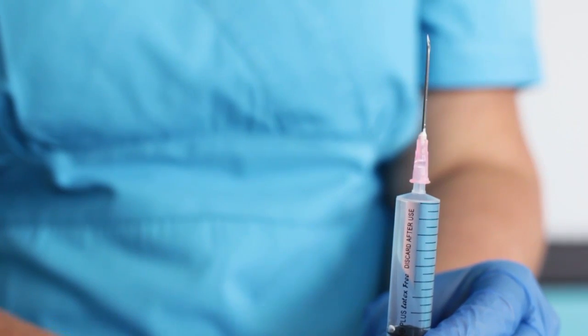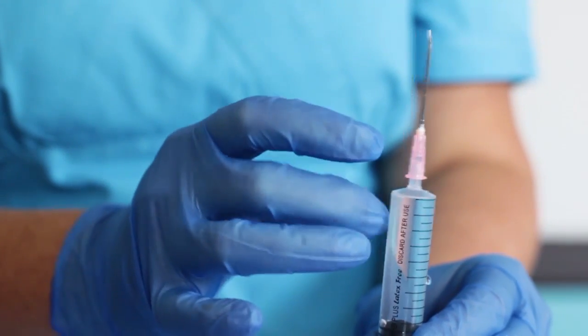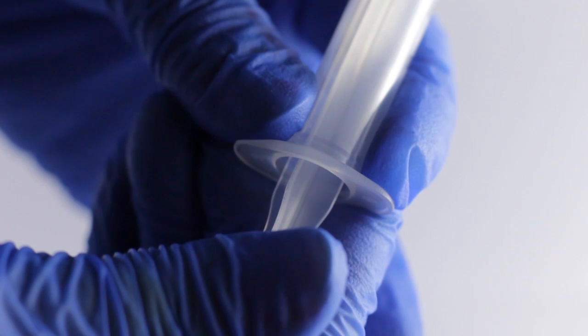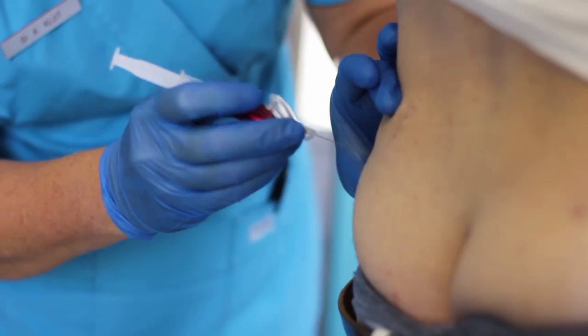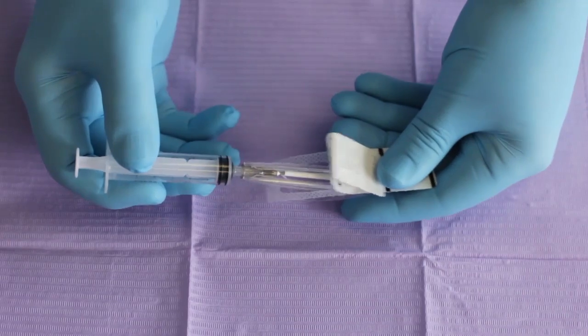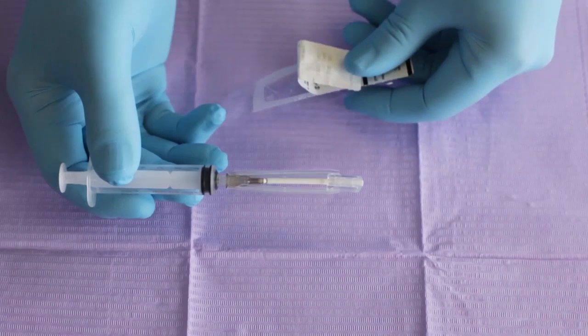To get rid of air bubbles, hold the syringe vertically with the needle pointing up. Tap the syringe gently to move any air bubbles toward the needle. Gently push the plunger to remove the air and any bubbles mixed with a couple of droplets of medicine. Prepare to administer the medication using the appropriate route. If you are going to give an intramuscular injection, appropriately discard the needle used to draw up the medication and place a new needle, preferably a safety needle, onto the syringe.